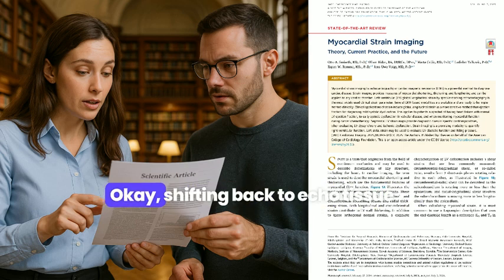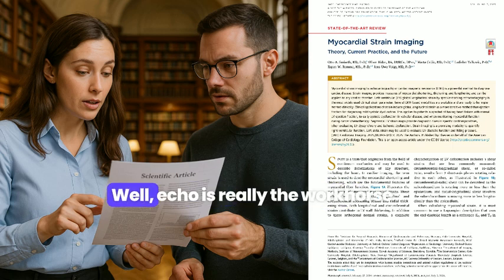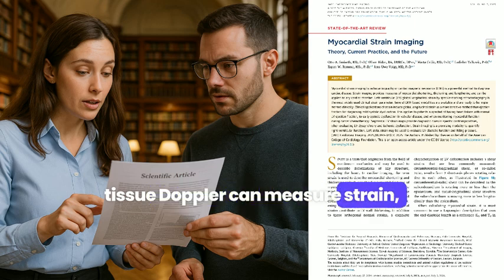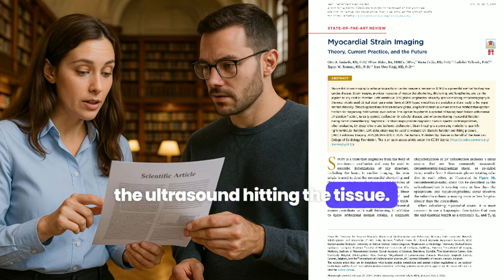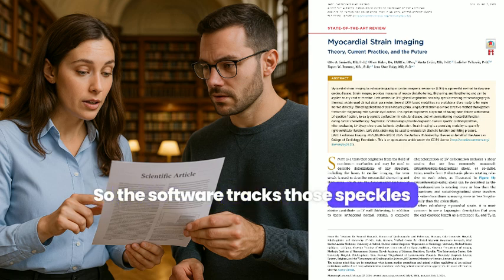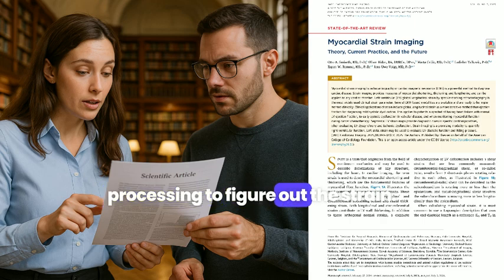Makes sense. Okay, shifting back to echo. Tissue Doppler versus speckle tracking. Why has STE taken over? Well, echo is really the workhorse for clinical strain, no doubt. Tissue Doppler can measure strain, but STE, speckle tracking, is just much more widely adopted. How does it work again? The speckles. They're basically interference patterns from the ultrasound hitting the tissue. They move with the muscle. So the software tracks those speckles in your standard echo loops during post-processing to figure out the strain.